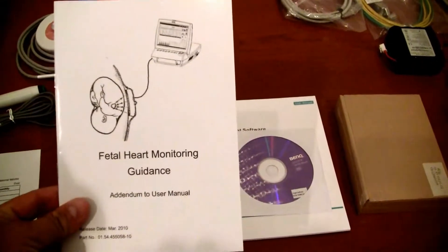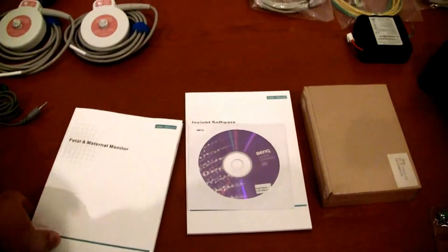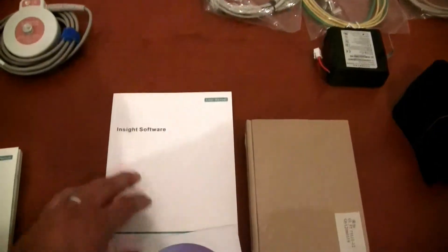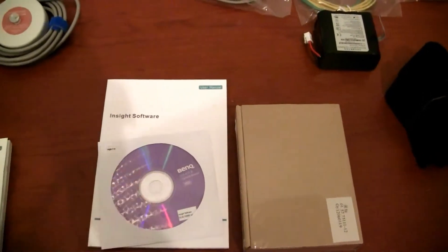There's a guide that comes for fetal heart rate monitoring guidance, as well as the actual user manual itself. As mentioned, it does come standard with the Insight software — there's a user manual for the Insight software as well as the CD-ROM for installation.